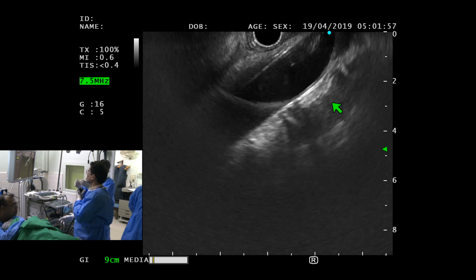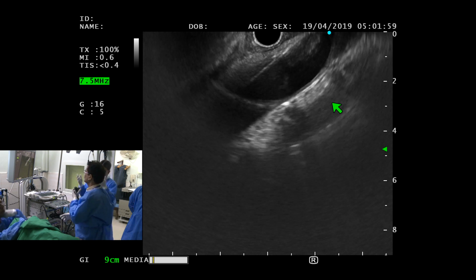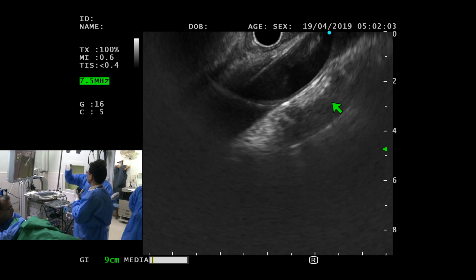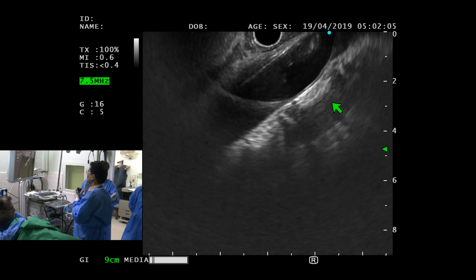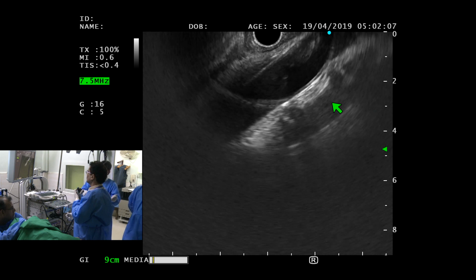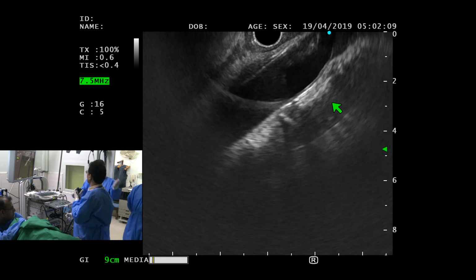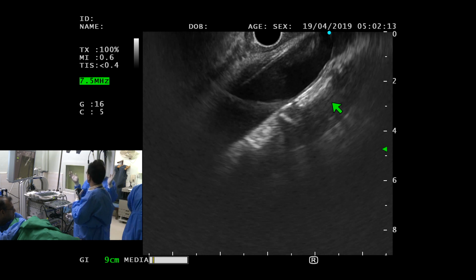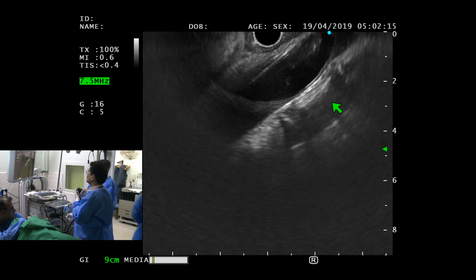So at this point, the usual maneuver is, ERCP में भी हम लोगों को पता है कि हमारा left hand left पे जाता है because we need to go through the cardia, which takes a slightly left curve. We then in the stomach, and then we take our ERCP scope here to look at the pylorus and we push through. Everyone agrees? And this is exactly what we need to do here.